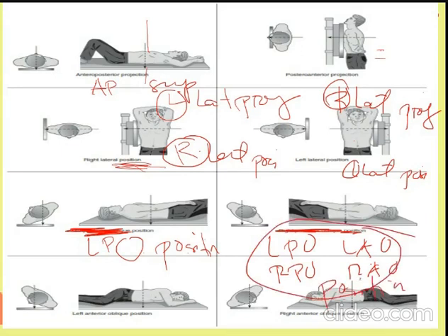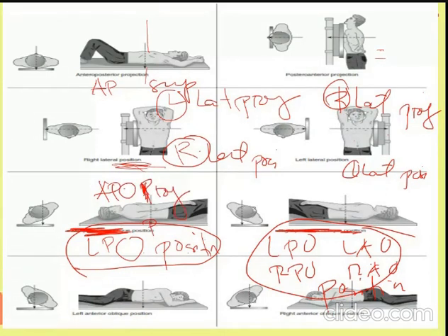If I am asking here, for example, of the projection, this is AP. It will enter the anterior portion, will exit the posterior portion. So this is AP oblique projection. Is that clear? Yes, Doc.